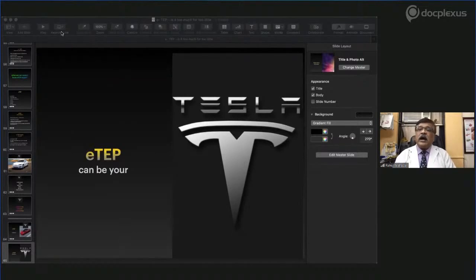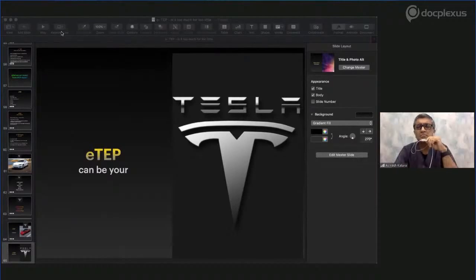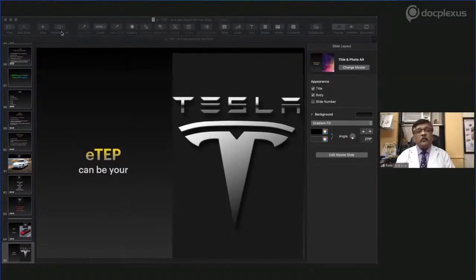If it is so, then for primary hernias, I go for IPOM plus, definitely. But if the cost is the problem, then I definitely think about E-TEP repairs. But mainly, according to the size, it should be 4 centimeters and above.